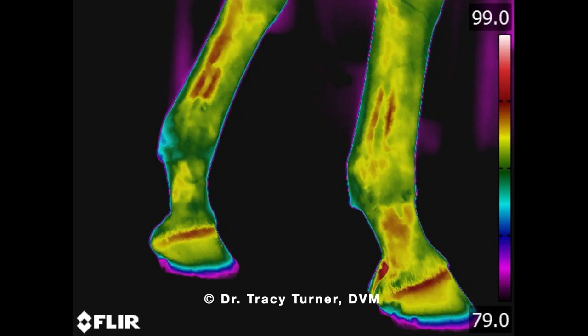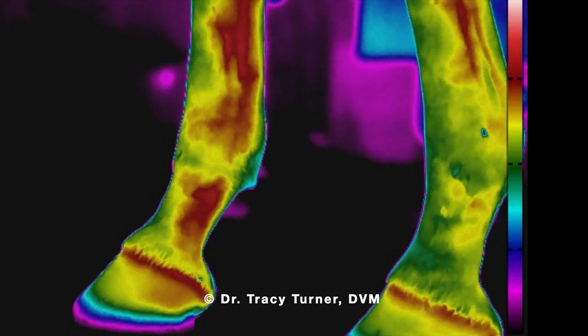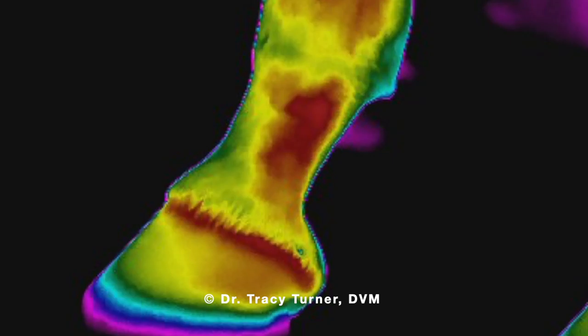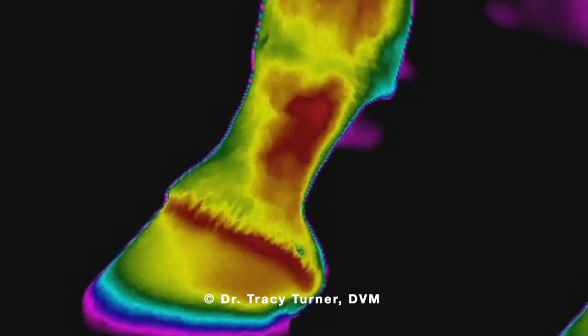In this third sequence of thermal imaging, we are an hour post Hoof Pro session. The horse had been put in the stall for that time frame, which was a warmer environment. As you can see, both limbs show an elevated thermal signature, which does correlate to the warmer environment. However, the right front still shows a significantly warmer temperature than the left front. Dr. Turner states that this is an indication of a sustained increase in circulation, even an hour post-treatment.